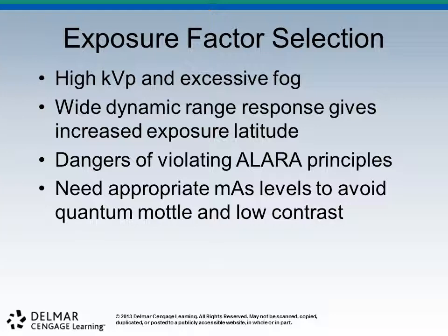All right, and then finally, the correct mAs levels. Too much or too little is going to cause us contrast and noise issues. And remember quantum mottle, as we said, the figure we looked at on the board was that randomized clumping of photons, and it looks like a real staticky, noisy image. Just remember that. It's that knee image that we've discussed. Okay, moving forward.